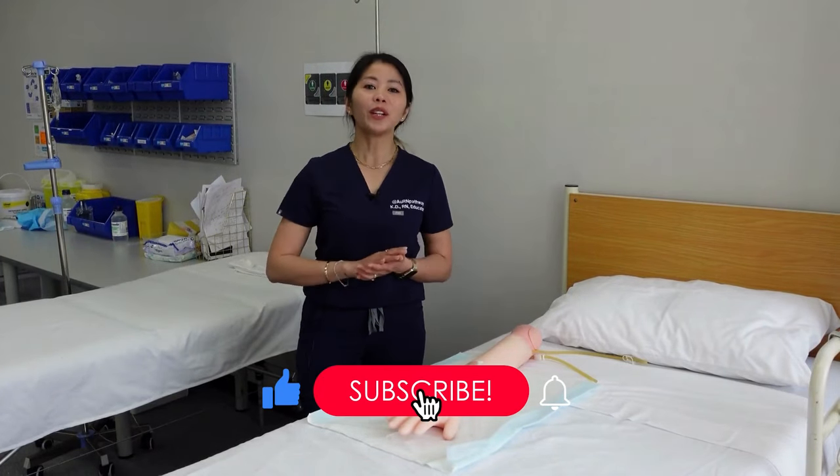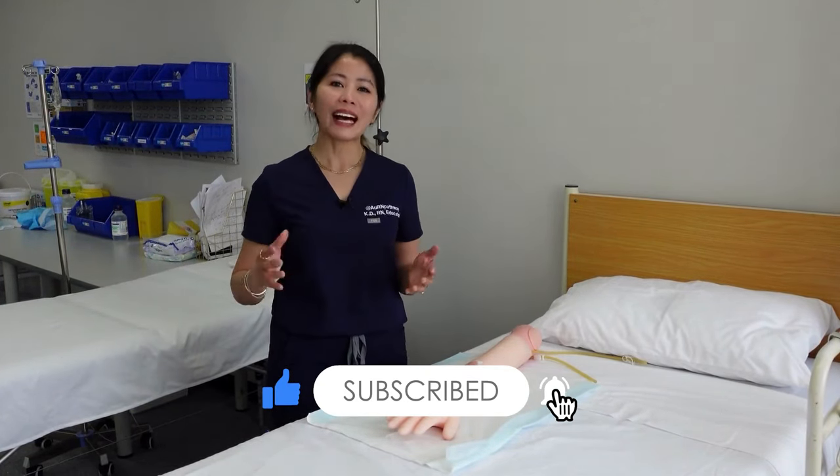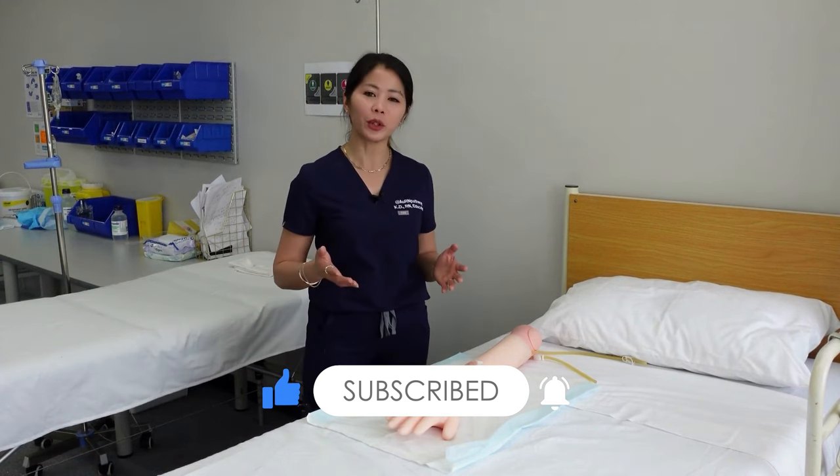In this video, you will learn how to perform aseptic non-touch technique for simple wound dressing.